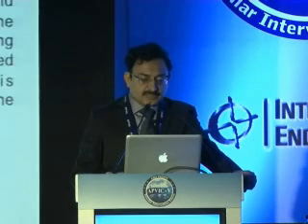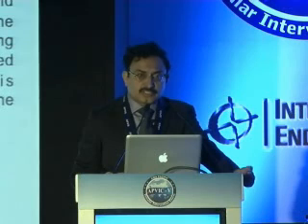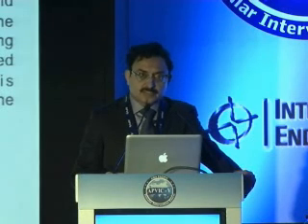Even for carotids, it's not difficult. Ipsilateral carotids can be hooked through a Simmons catheter. Even the contralateral carotids are hooked through a Simmons catheter. Then we pass in a hydrophilic guide wire and position it into the external carotid artery. Then we advance this diagnostic catheter into the external. Then exchange it with an Amplatz wire, stiff Amplatz wire, and then put a sheath over this. So once we get an access to carotid, we can treat these lesions.